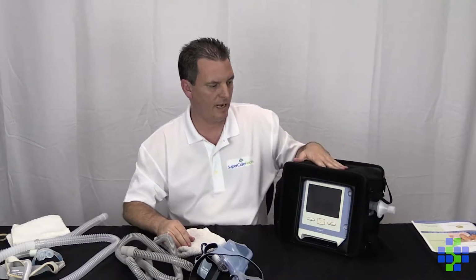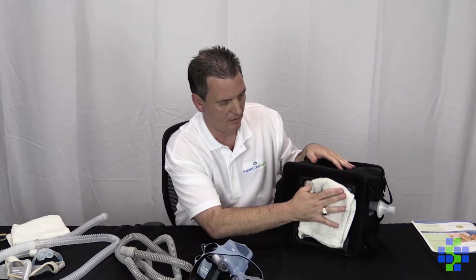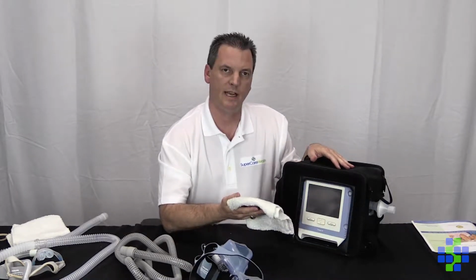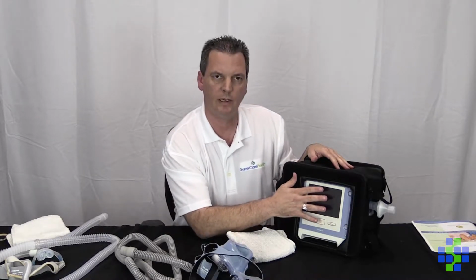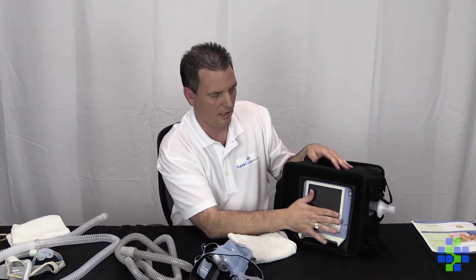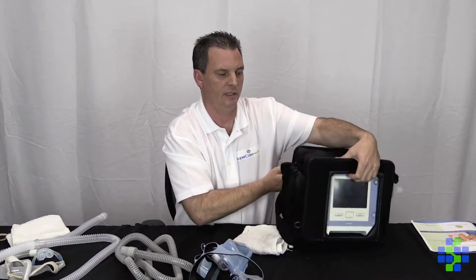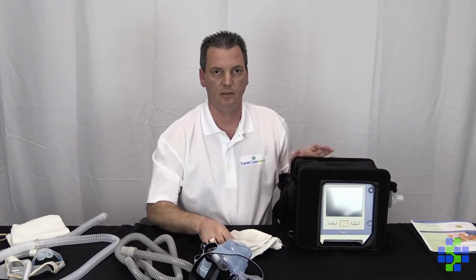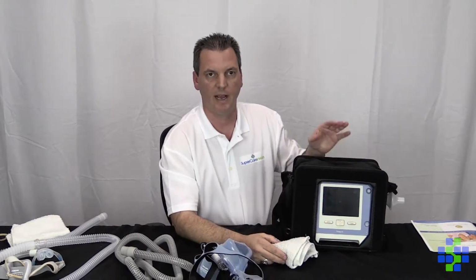When it comes to the device, I would recommend daily just wiping it down with only a damp cloth. You certainly don't want to use any abrasive soap or anything like Comet or any hard material to clean this, specifically this window or the screen. Most importantly, you're doing this while it's unplugged. You certainly don't want to have this plugged in and use any water on it, especially around the battery area.